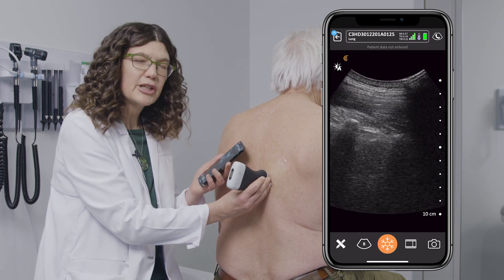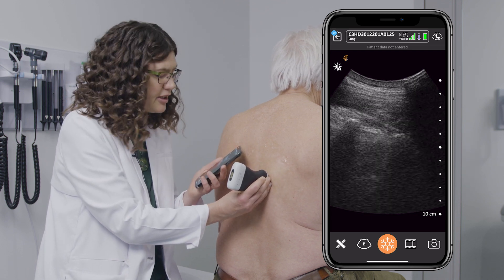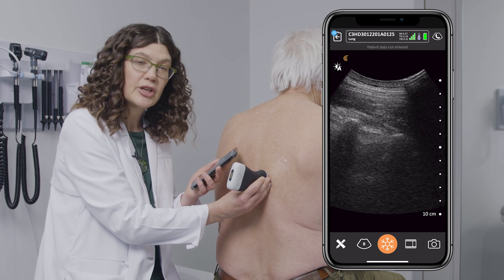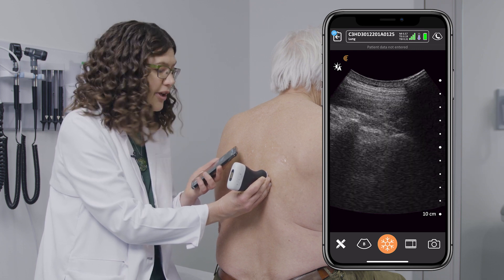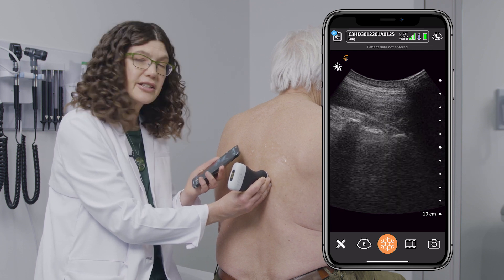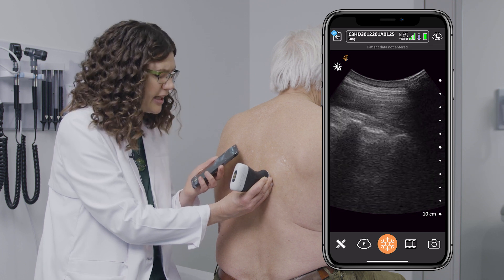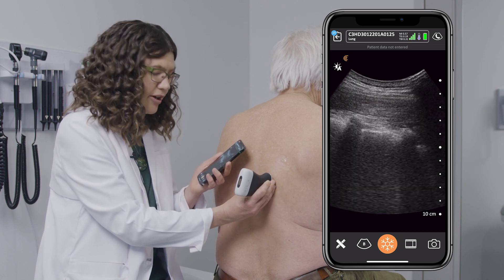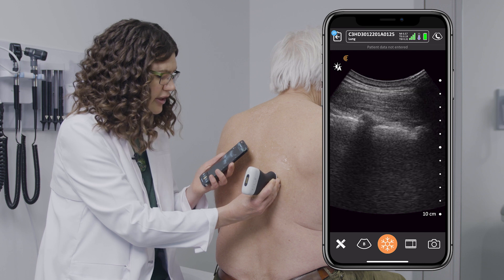This is a really important exam in family medicine — it's one of the most common that I use, looking either for congestive heart failure, in which case I would see B-lines bilaterally, or pneumonia, where I would see B-lines unilaterally.